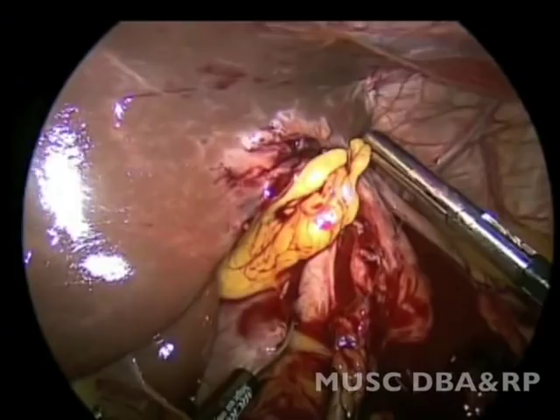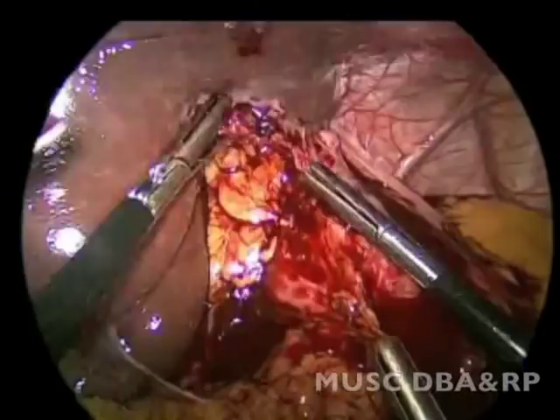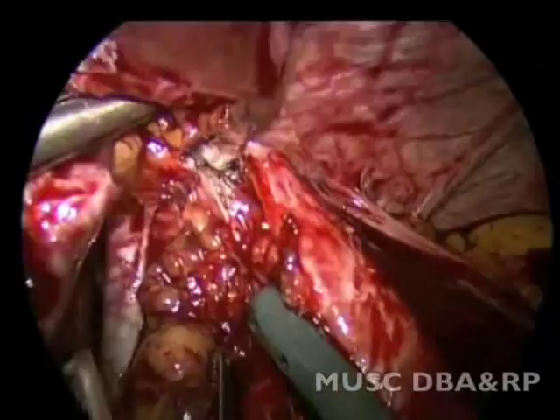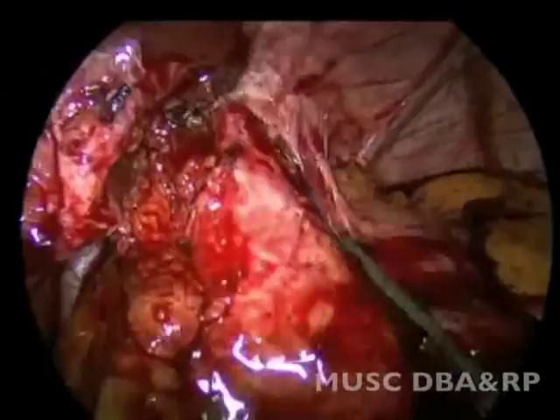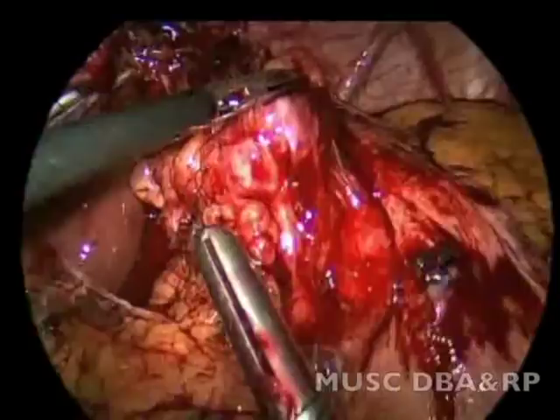The right crus of the diaphragm was identified. Once the left lobe was completely elevated, a liver retractor was placed.